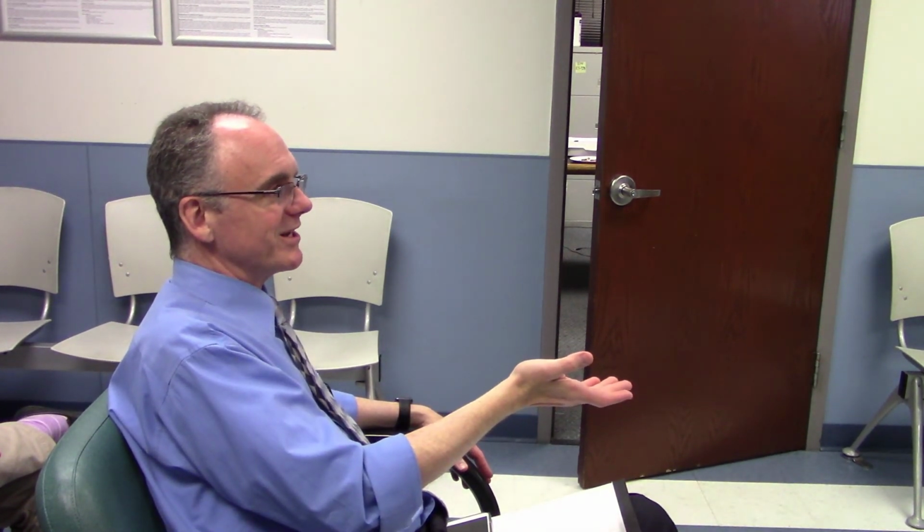Right, this could also be a stepping stone. Yeah, that's what I'm thinking. Let's say 70% of the time they see a suspicious looking joint, then they'll say, oh well, if the patient is still symptomatic, perhaps we should have them come back and do the sitting X-ray.